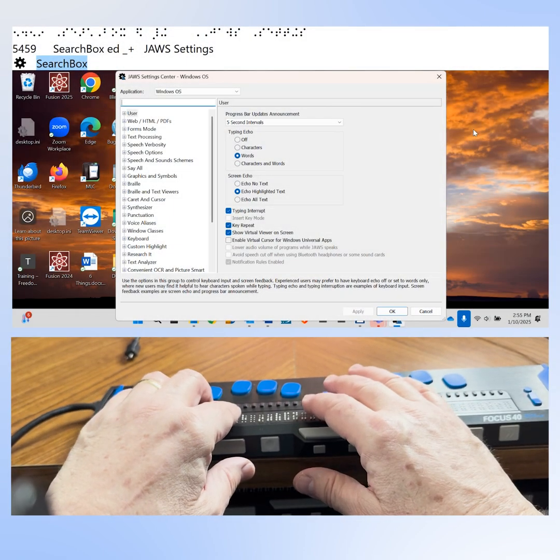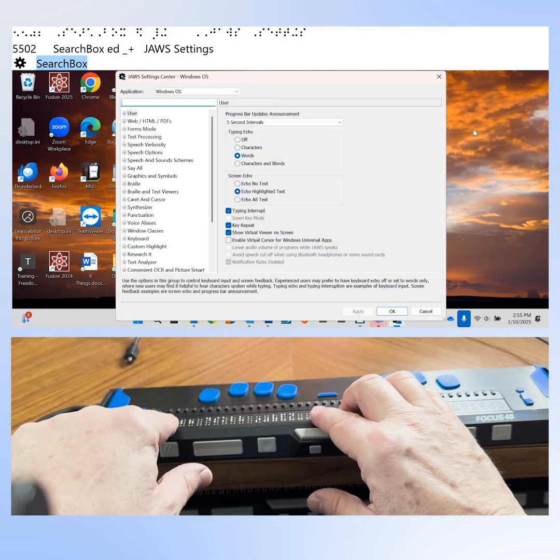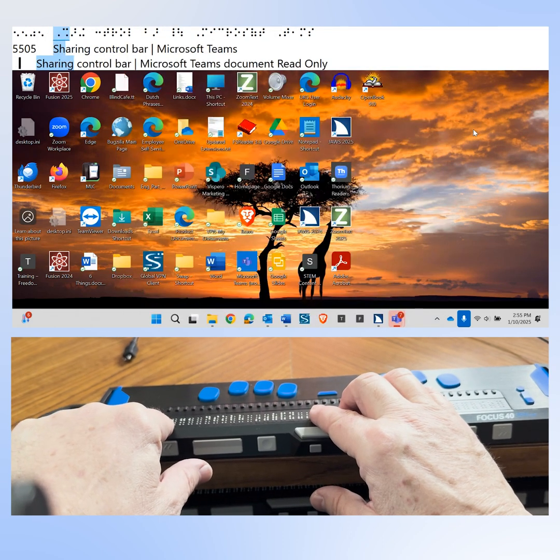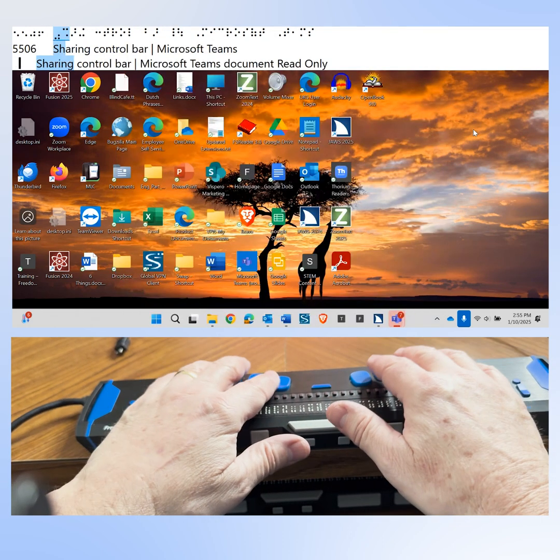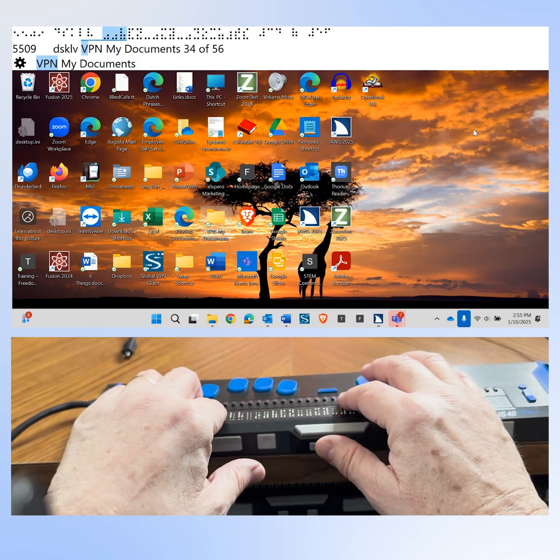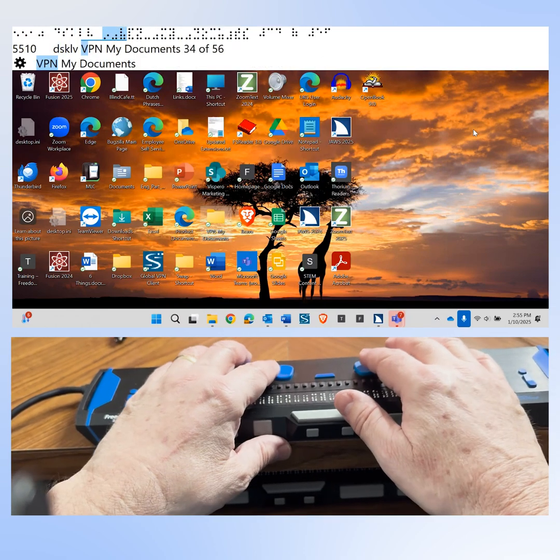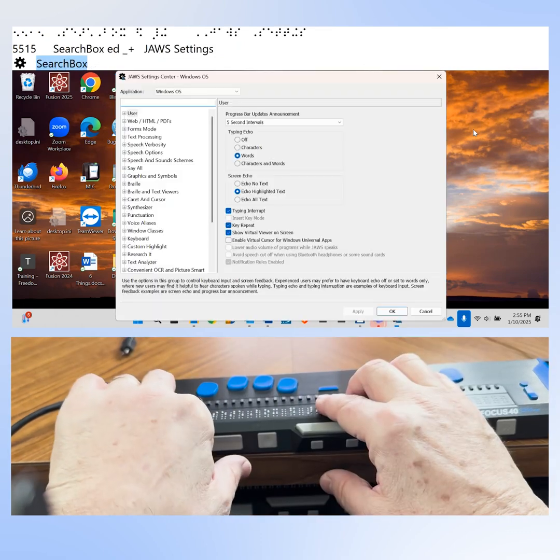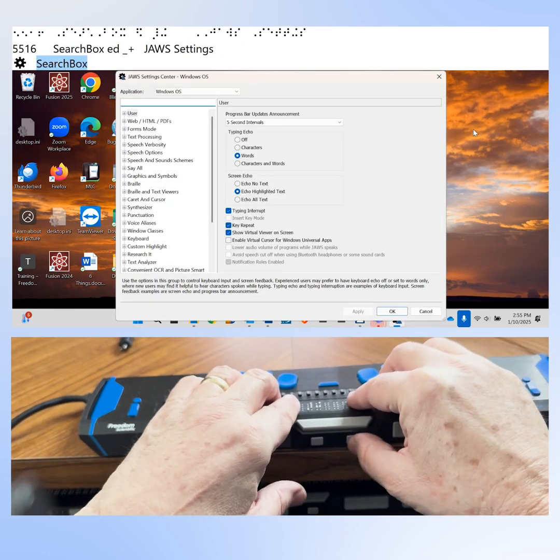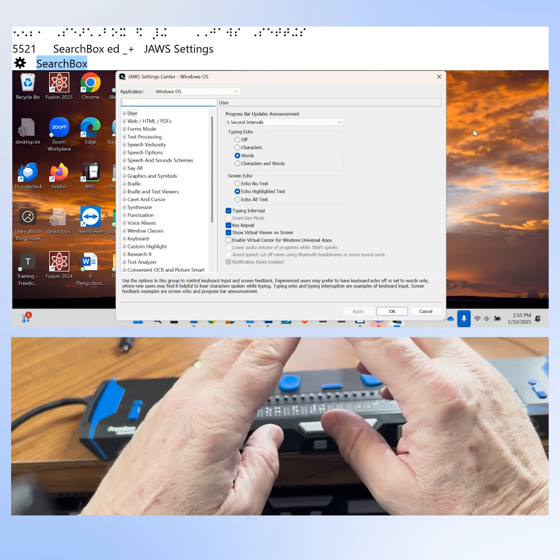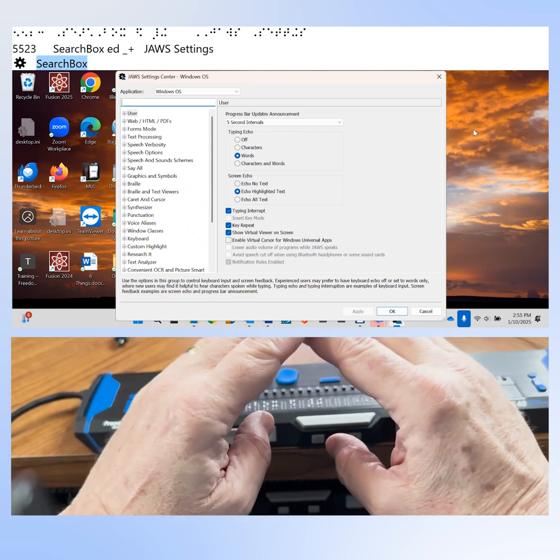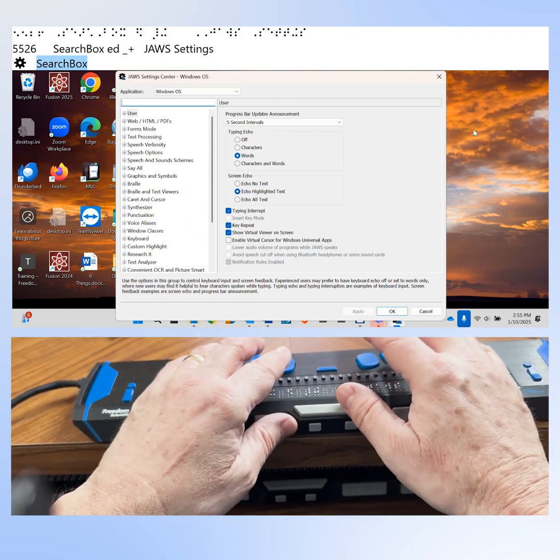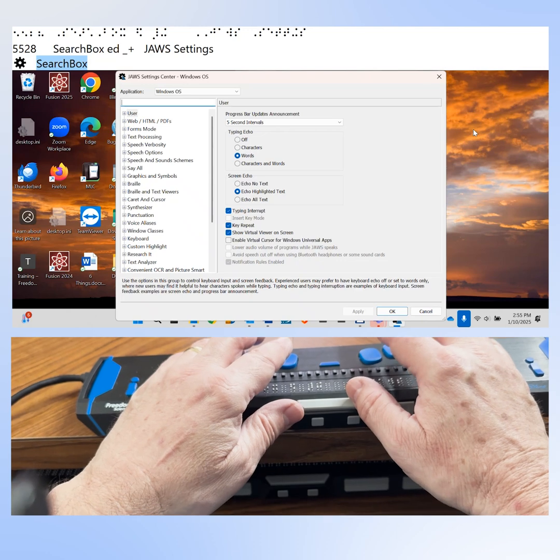On my computer right now, JAWS is set to display status cells at the left end of my braille display. I'm going to show you how to turn that off. The first thing we need to do is go into JAWS Settings Center. You're going to press Insert and Number Row 6. We want to set the Settings Center so that all of your changes are applied globally. We're going to press Control Shift D.